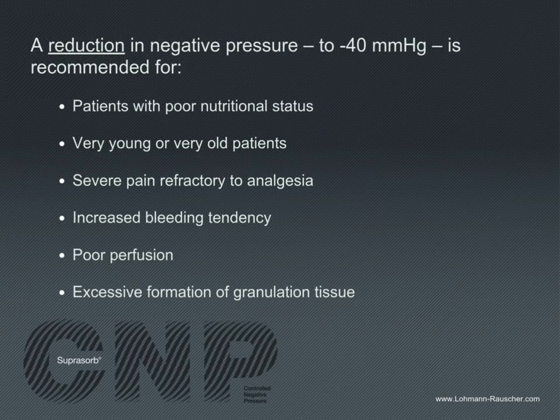A reduction in negative pressure to -40 mmHg is recommended for: 1. Patients with poor nutritional status. 2. Very young or very old patients. 3. Severe pain refractory to analgesia. 4. Increased bleeding tendency. 5. Poor perfusion. 6. Excessive formation of granulation tissue.